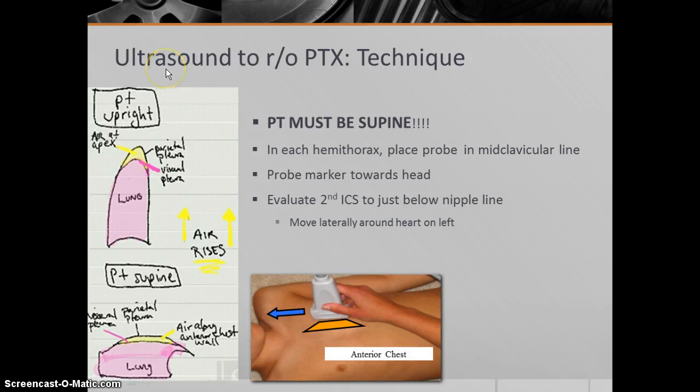An important thing when looking for pneumothorax with ultrasound is that it's very dependent on your technique. When the patient is upright, the air in the thoracic cavity rises to the least dependent portion of the chest cavity and collects at the apices. Whereas when the patient is supine, the air will collect along the anterior chest wall. It's important to have the patient supine because when we scan for pneumothorax, we scan along the anterior chest wall on either side — left and right — placing the probe in the mid-clavicular line with the probe marker up towards the head, and then evaluating each intercostal space working our way down. Keep in mind that on the left side, you often have to move just laterally to get around the heart.